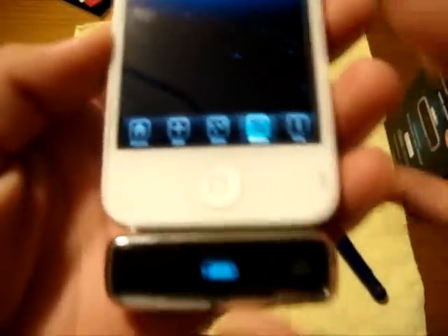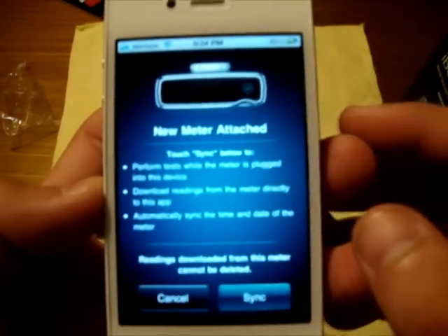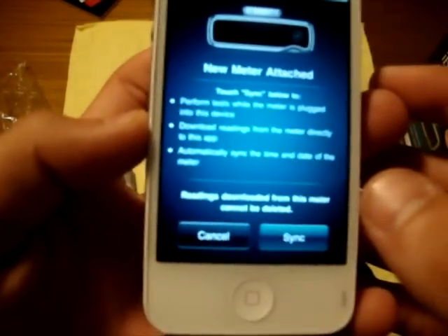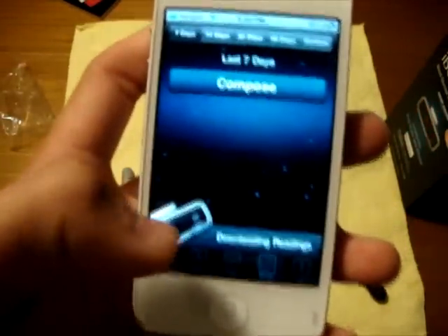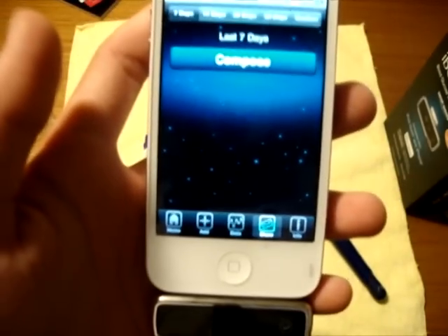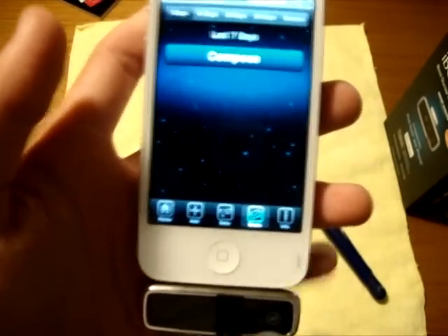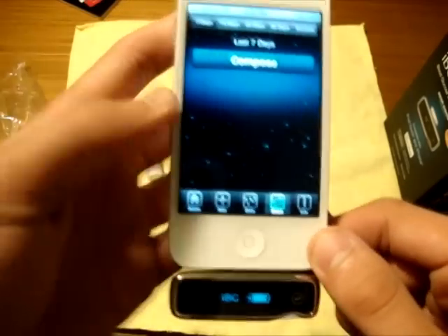We plug it in and it shows the battery life right here, which is really cool. It pops up 'new meter attached.' From here you choose to sync it or cancel — I'm going to hit sync. Now it's got it all set up.